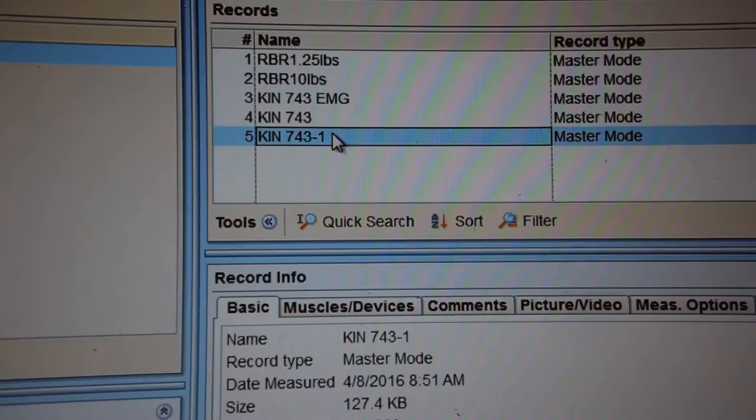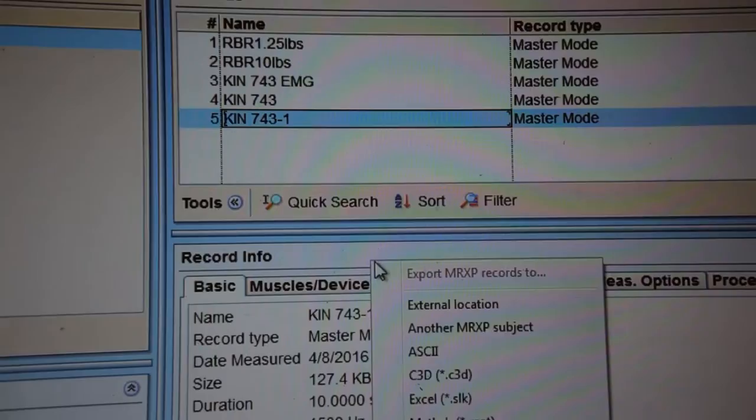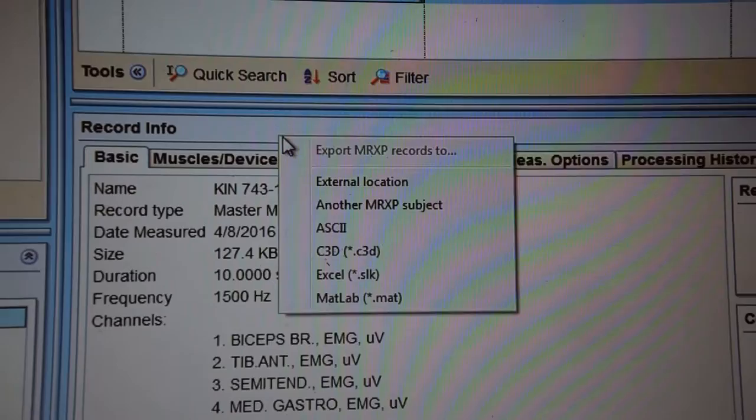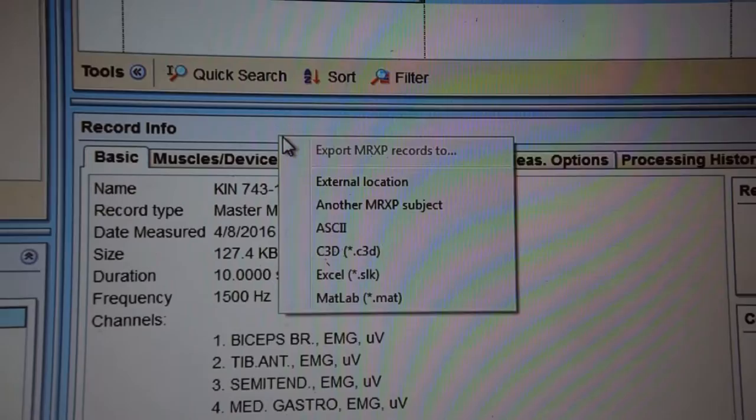To export this, we will just right click on it. And you will hit export to. And you can export this to an ASCII file. Your basic text file. A C3D, Excel, or a MATLAB file. And whichever file you need to export to, click it. And you can choose a name for it.